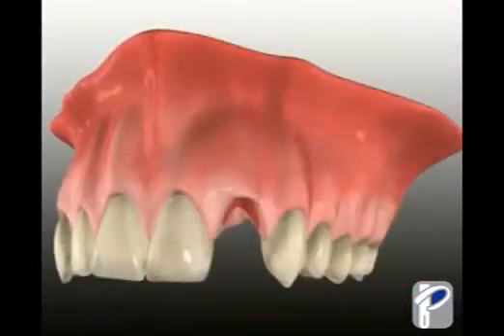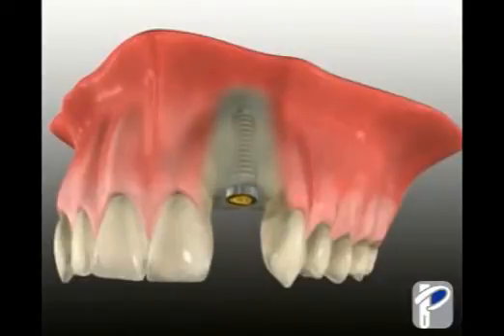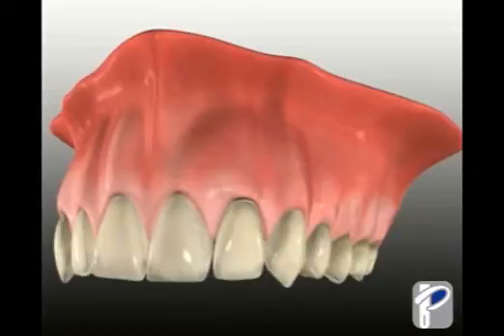Replacement of missing teeth with Nobel BioCare implants means no drilling down the adjacent teeth. Your doctor simply places the implant, the abutment, and then the crown, giving you back full functionality and a reason to smile.